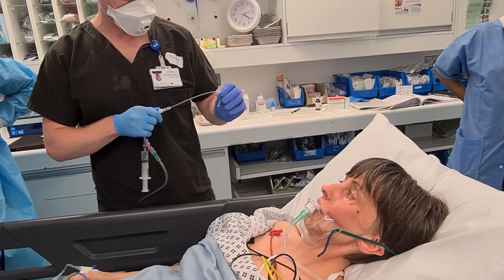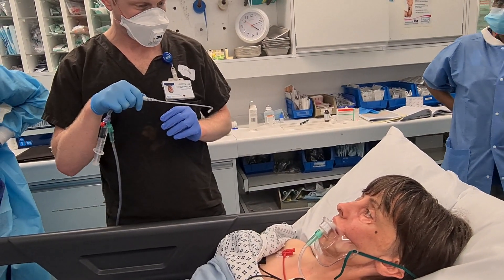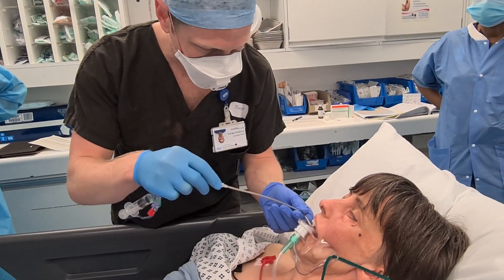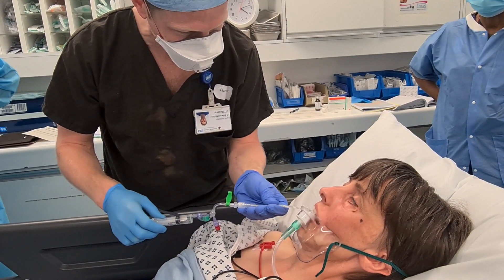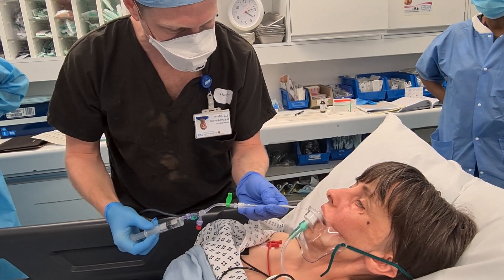So I'm just bending the end of this. I'm going to aim it at the back of your throat, and then we're going to try that deep breathing again. Open your mouth for me again. Well done. How does that feel? Is that alright at the back there? If I press at the back, is that okay? No gagging. So just keep doing a deep breath in and out.